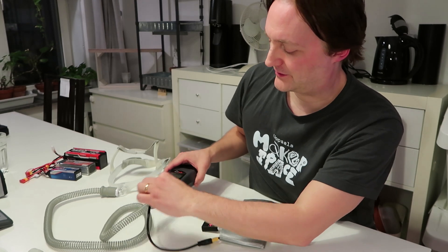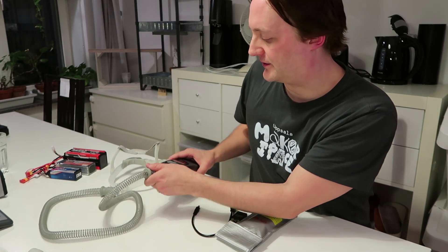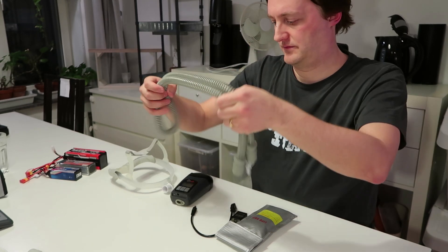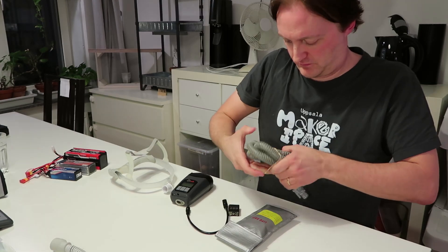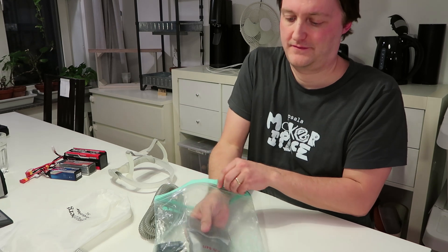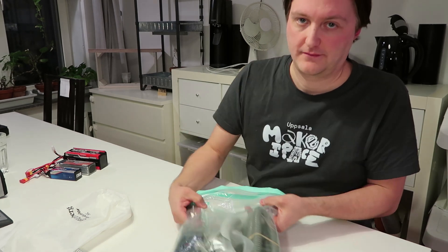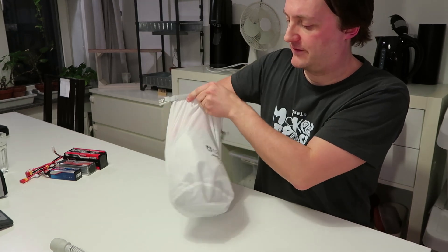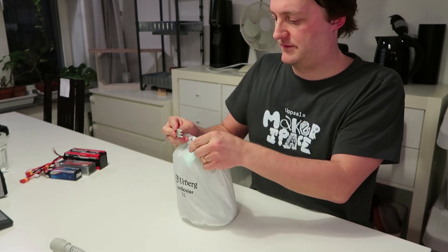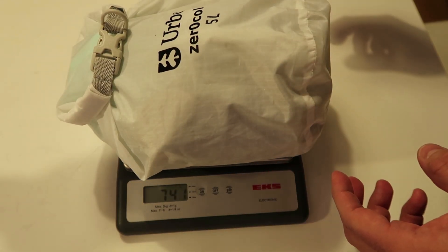Now let's disassemble everything, pack it up, and see how much it weighs. I disconnect all the cables and the hose, then put everything in a plastic bag for extra protection against water. Since I'm hiking I also use a stuff sack for extra protection. The total weight comes to 741 grams.